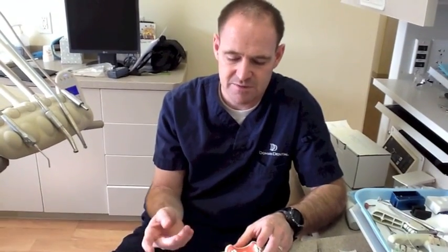Okay? Then we come in, and then I'll take it out, and we'll trim the teeth and take our impressions. Okay? That's it. Simple put for packing cord.